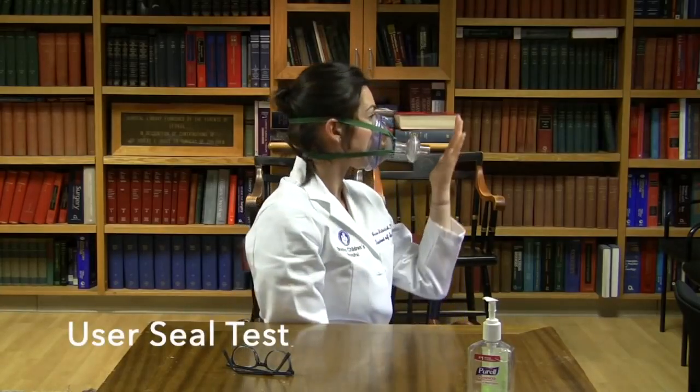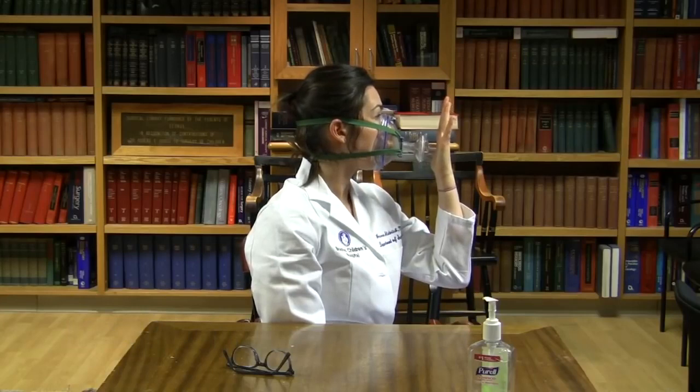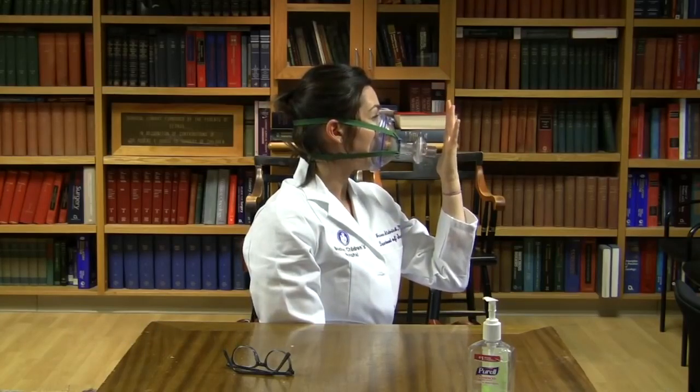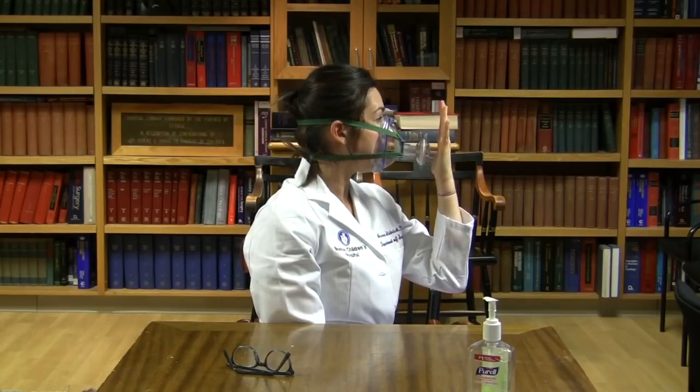You will now perform a user seal test. Perform a negative pressure test by placing your hand over the end of the mask covering the inlet and inhale. Make sure while doing this you are not adding additional force onto the mask. If the mask has a good seal around your face, you should not be able to inhale. Now perform a positive pressure test. Again, place your hand over the inlet and now exhale.